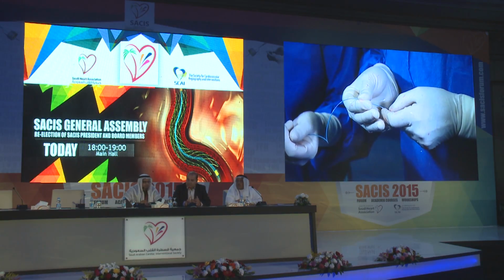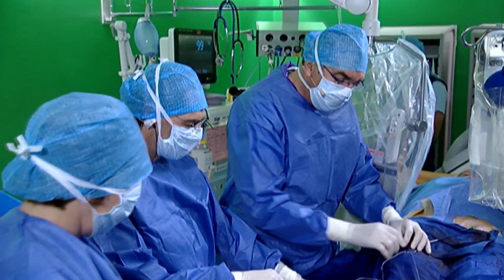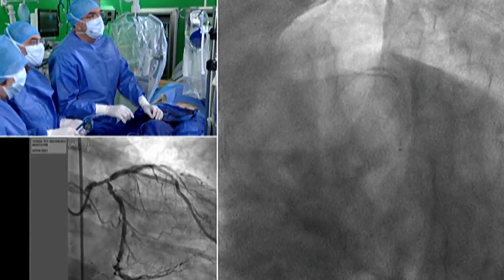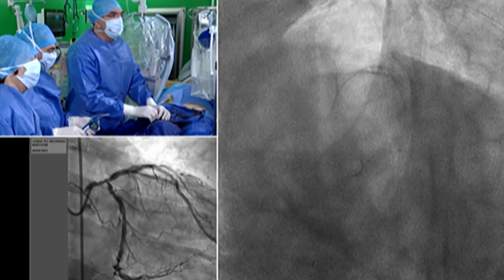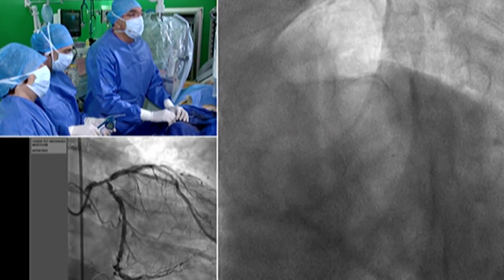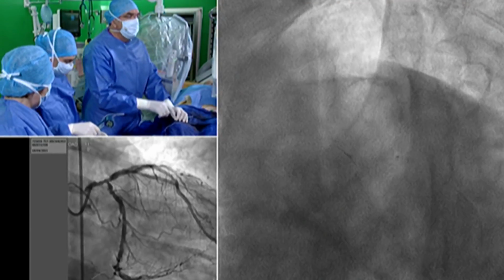You know that, Ethan, we know that the use of the proximal optimization, what we call the wire is out. No, it's the other one. No, sorry. Anybody from the audience has any comments? No, it's okay.